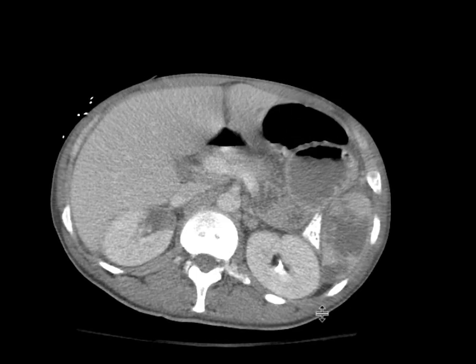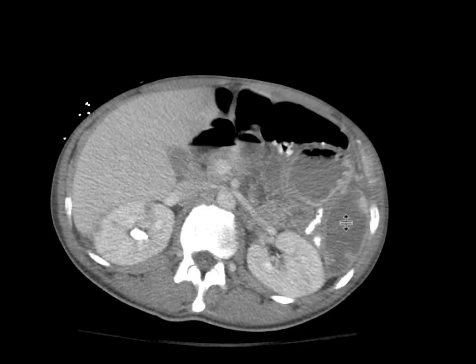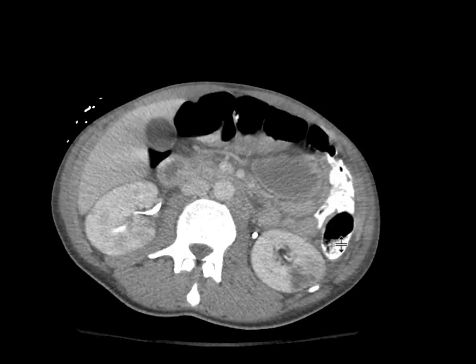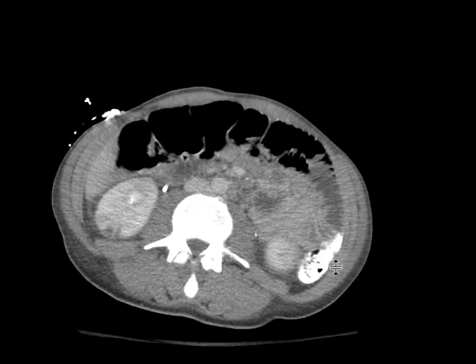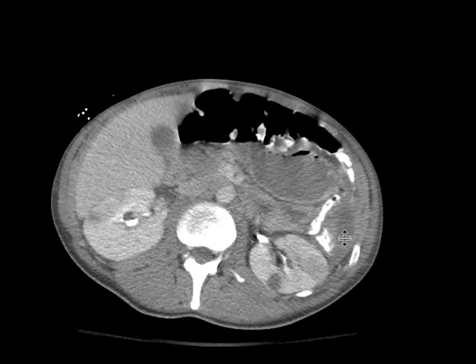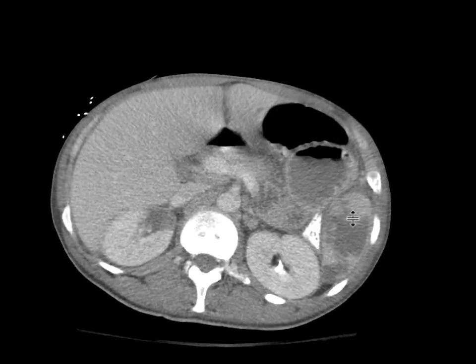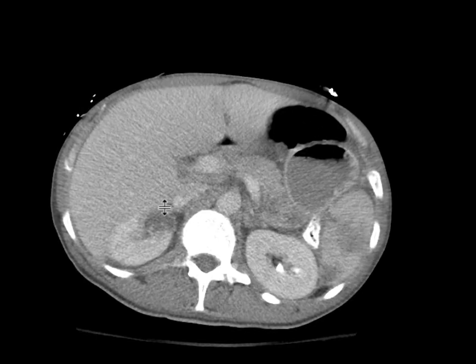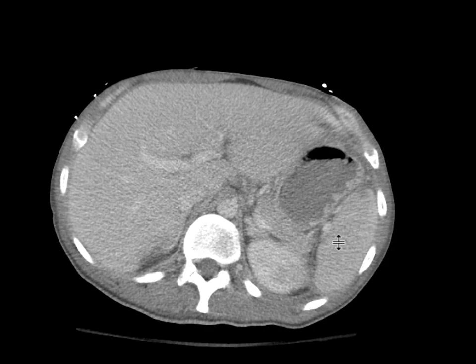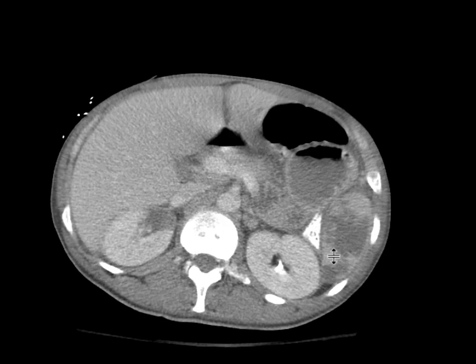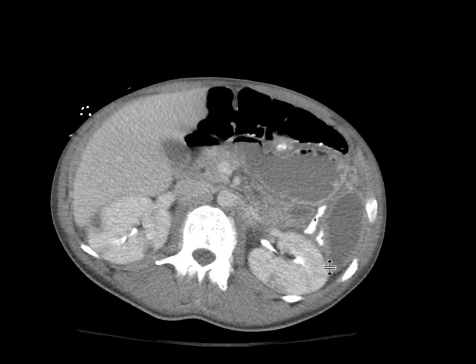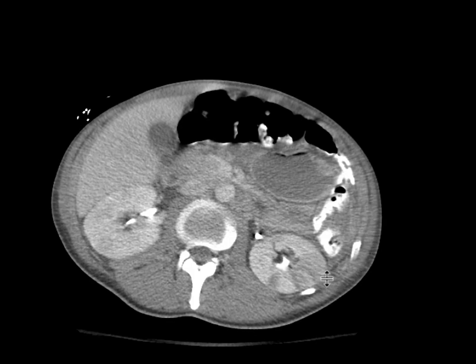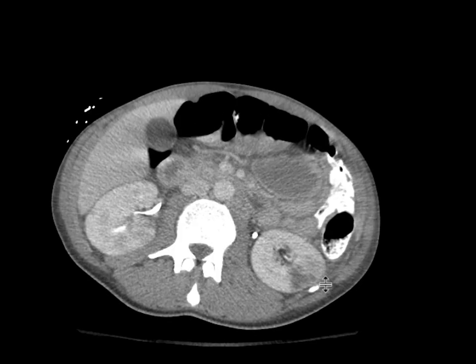When you look at the kidneys as well, we can see similar findings in both kidneys — areas of linear to wedge-shaped regions of hypoattenuation extending from the central portion of the kidney all the way out to the periphery. These are great looks for infarcts within the kidney.